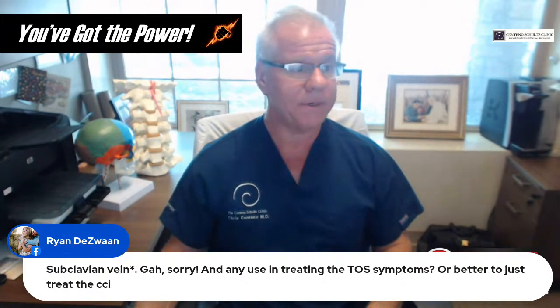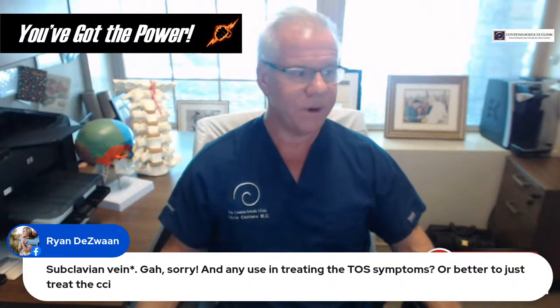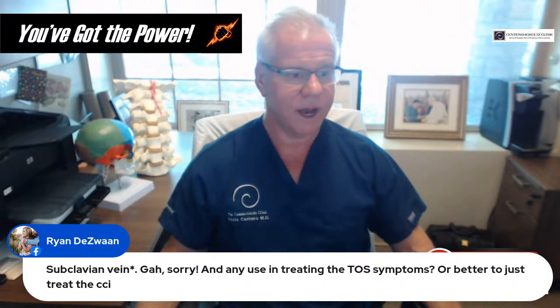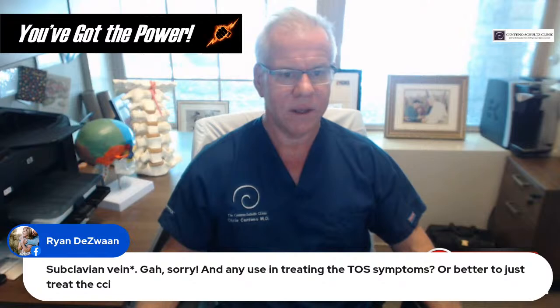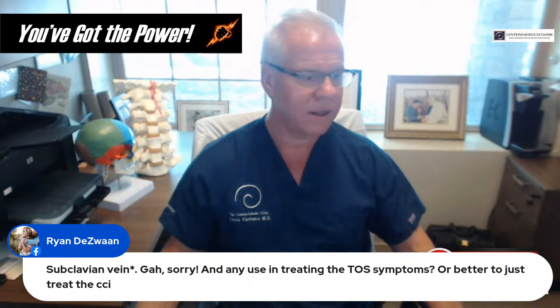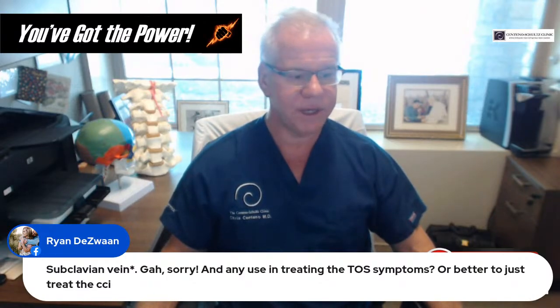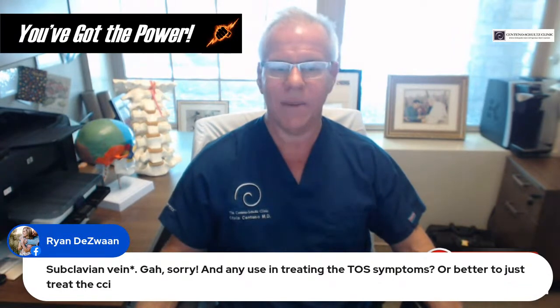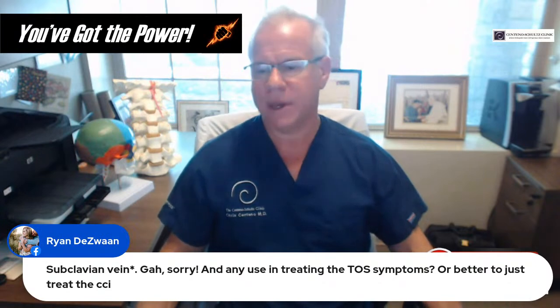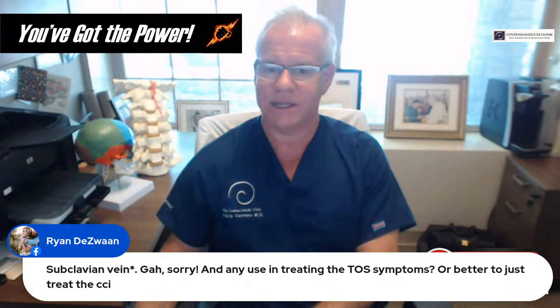So I'm going to pull up some images here that may help everyone understand what we're talking about a little better. Okay, this is a good one. I'm going to put this image in a PowerPoint so we can blow it up. Again, I'm going to talk a bit about thoracic outlet because it's so common in patients with lots of different neck issues, not only CCI.